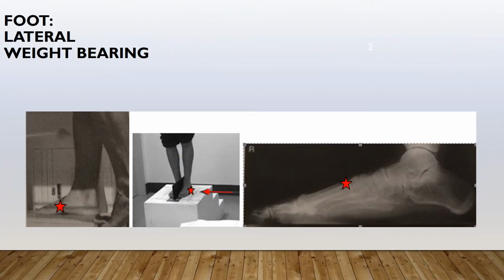Now here is a lateral weight-bearing view. I'm showing you a couple different ways to perform this x-ray. In the one x-ray, I have the center ray entering medial and going out lateral, but that is not a true weight-bearing lateral. The second image is a true weight-bearing lateral. So we're going to have the patient standing, place the medial portion of the foot against the image receptor, center the foot and adjust the foot so that the entire foot is parallel to the image receptor, direct the center ray to enter at the base of the third metatarsal, mark this weight-bearing.